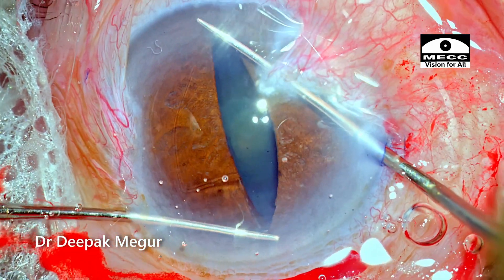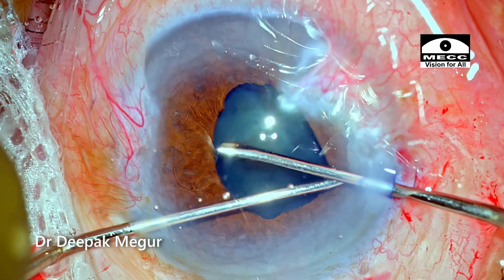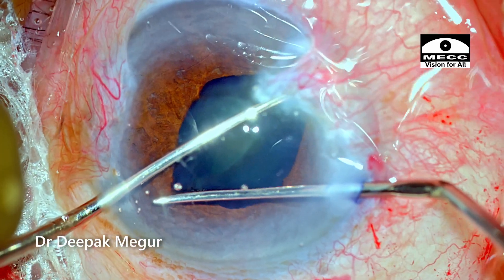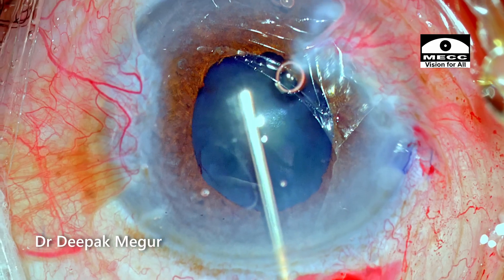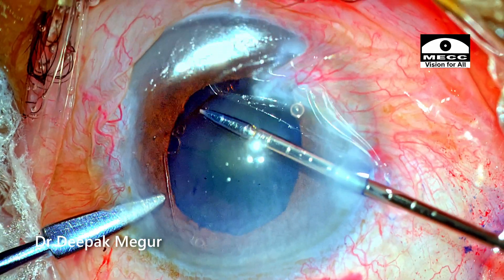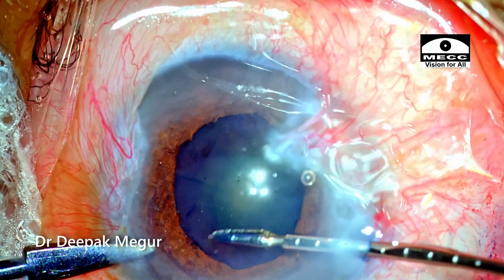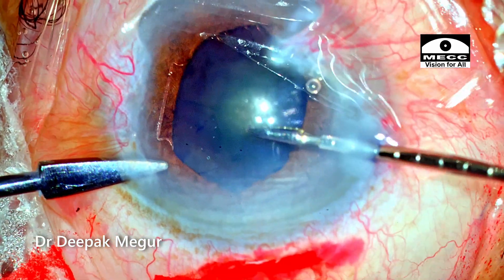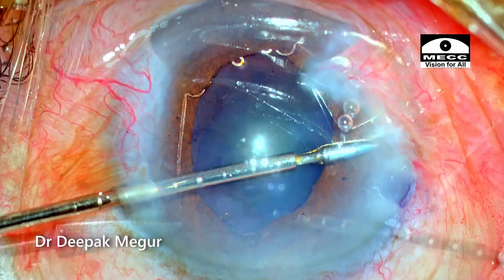I'm going to stretch the pupil in the typical fashion I describe quite often — I do it in four meridians. As I'm stretching, I can feel the sphincters giving way in at least a couple of occasions. This was intentional because we wanted to break those fibrous strands of the rigid pupil. This is when the pupil actually dilates. The pupil is now dilated well enough to complete the surgery. I'm going to use the B-hex device primarily to deal with the flopping of the iris, since once the sphincters are torn and the pupil is dilated, there is a chance the iris will become extremely floppy. In this situation, it is predominantly a device to hold the iris in place rather than an expansion device, because expansion has already happened.